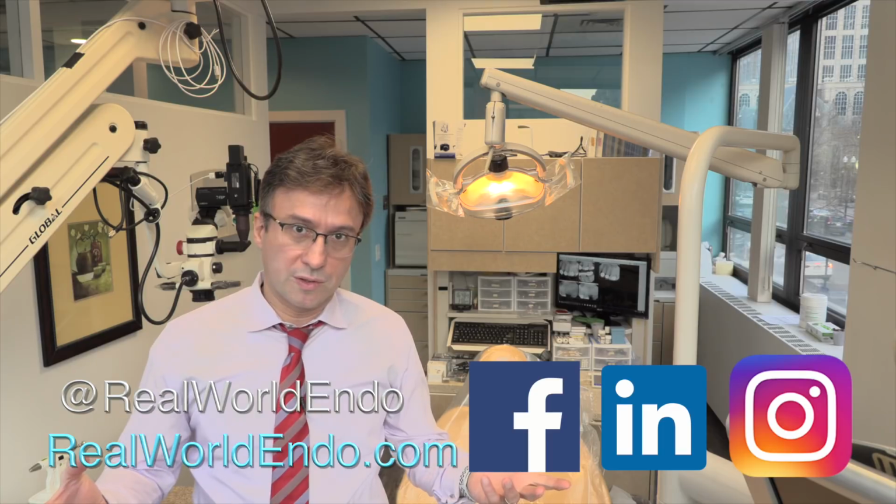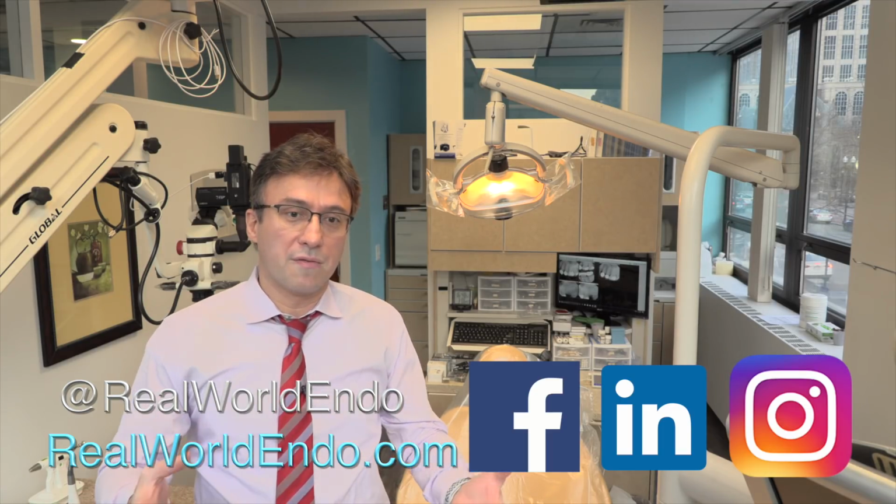CBCT in this case was certainly helpful. Had I not had the CBCT, I probably would have done the endo on this patient. Given the fact that the distal buccal root was a free-floating object with necrotic material in it, most likely the distal probing would not have resolved on its own, so we probably would have required some additional investigation, and possibly at that point either extraction or another surgery to retrieve and remove the distal buccal root, and then see whether the area would recover or not.